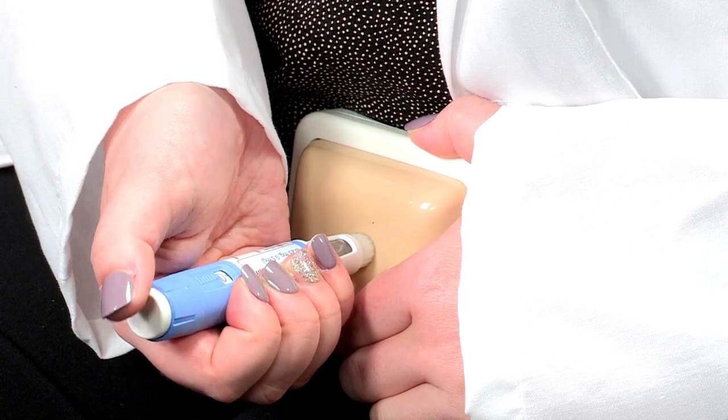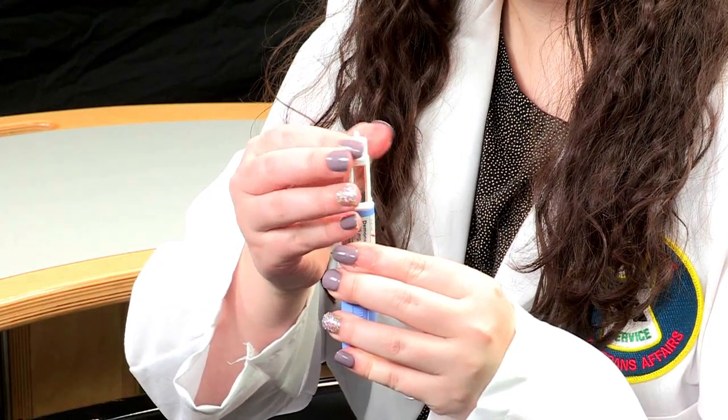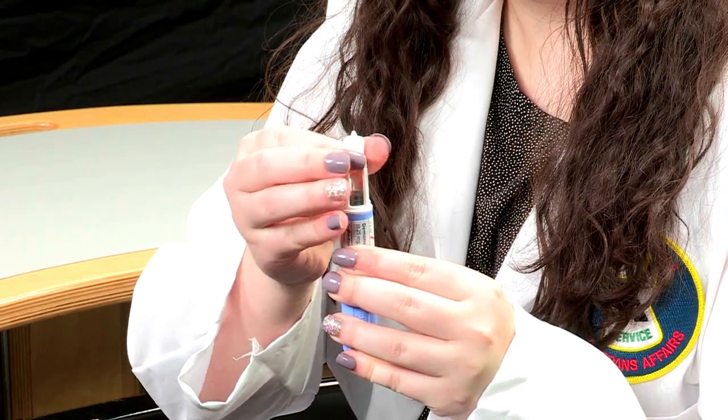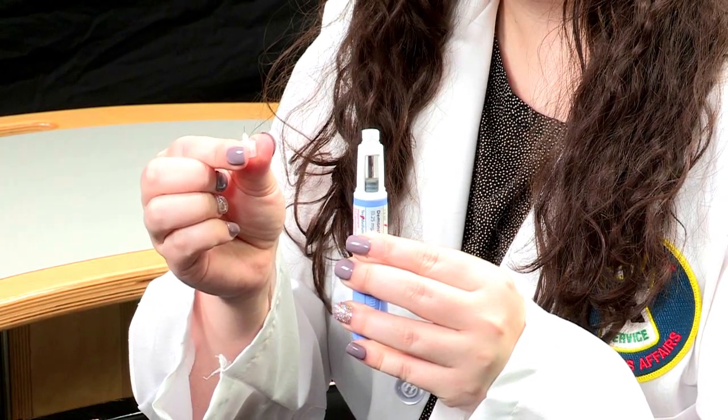Once the six seconds are over, you can pull the needle out of your skin. Do not rub the injection area. If you see a small spot of blood, lightly dab the injection area with a gauze or a cotton ball. If after six seconds the dose counter does not move and zero does not appear in the dosing window, you may have a blocked or damaged needle, and this may also mean you did not receive any medication. Just replace the needle, keep the dosing counter at the same spot, and try again. After completing your injection, carefully unscrew the needle from the pen. You can point the needle up and unscrew from the bottom to avoid accidentally pricking your finger. Do not try to recap the needle.